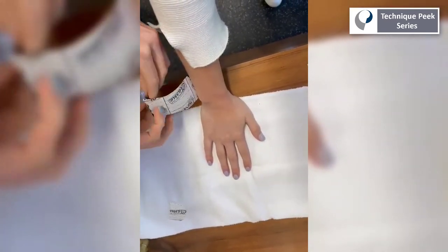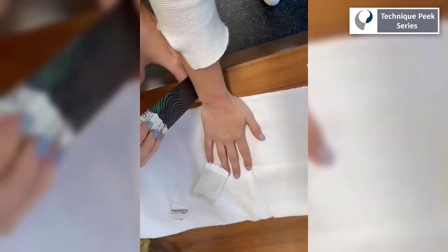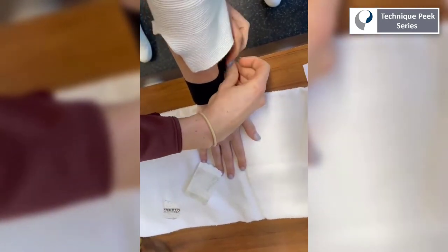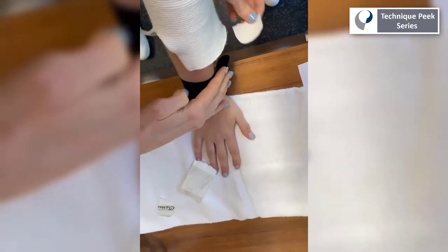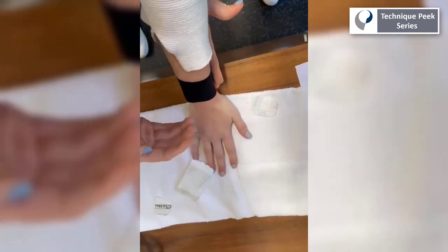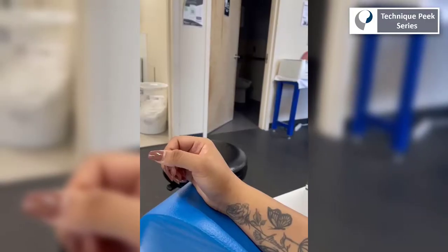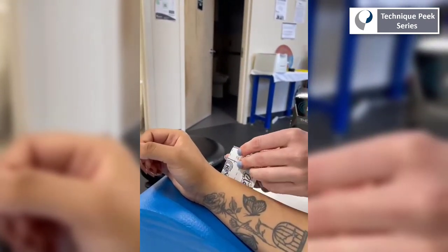Once you determine which direction provides the patient with the most relief, tape the area so the skin is being pulled in that same direction. Remembering that the skin will be pulled in the direction of the anchor — in this instance, the patient reported the greatest relief at the 3 o'clock direction, so the anchor must be placed with no tension on the ulnar side of the wrist. Pull the kinesio tape about 50% tension, then lay down the tail with 0% tension.